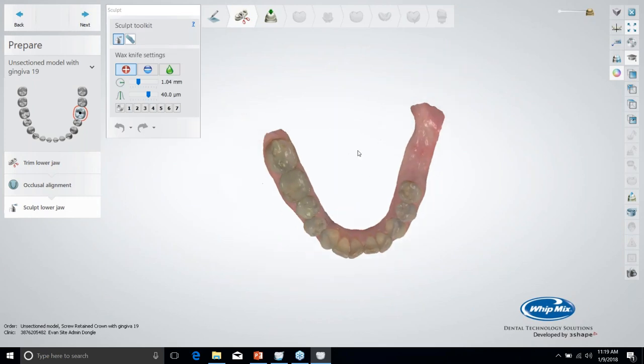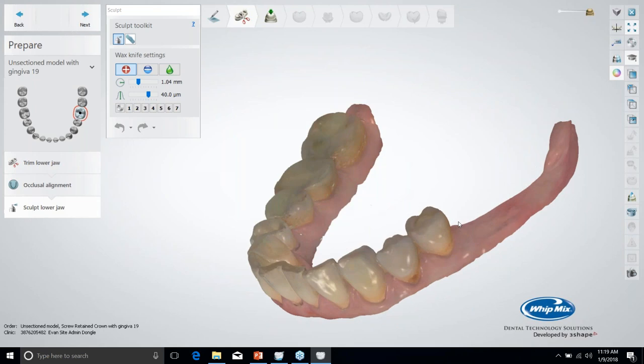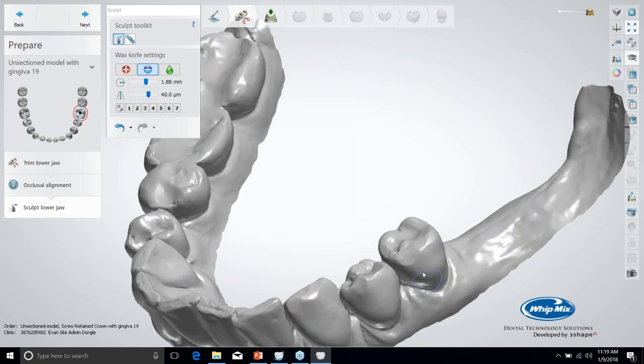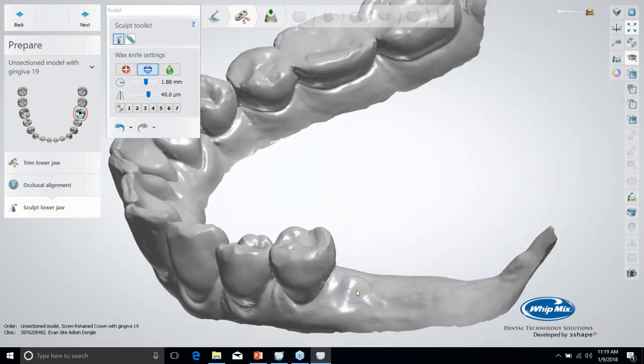Now I've got the ability to sculpt on the scan if I want to change the contour of anything. If I want to sculpt tissue, then you can actually come in and sculpt tissue, which you can probably see better if I turn the color off. Now, of course, you don't want to change anything that may negatively influence your design.